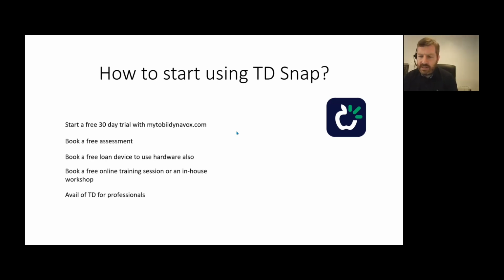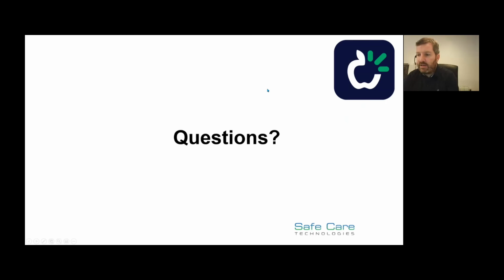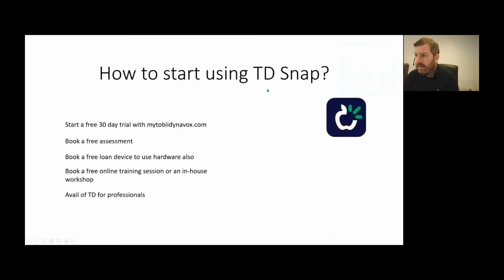And with the TD for Professionals, and Michael may have to correct me if I'm wrong on this, but last I heard you do get Pod and Gateway included, so they're not a paid extra for professionals. So if you are working with someone that uses Pod or Gateway as a professional, you will get them for free to work with them. We'll send you all the links on how to do that.